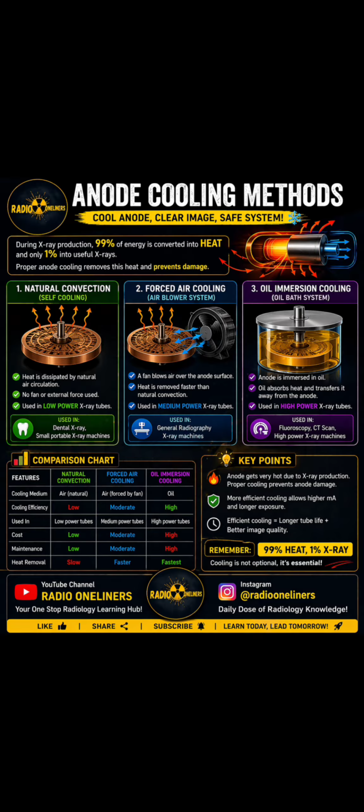Second is forced air cooling or air blower system. I have already mentioned everything related to your notes in this diagram. Go through this diagram and you can attempt your exam. So forced cooling or forced air cooling. Now we move to a more efficient method, which is obviously the forced cooling method.